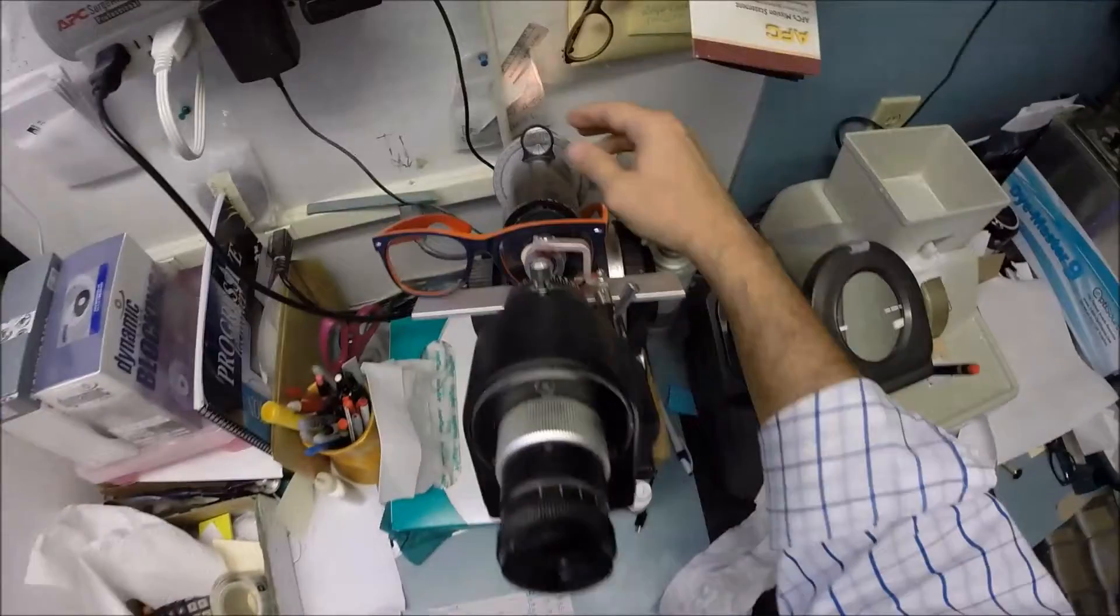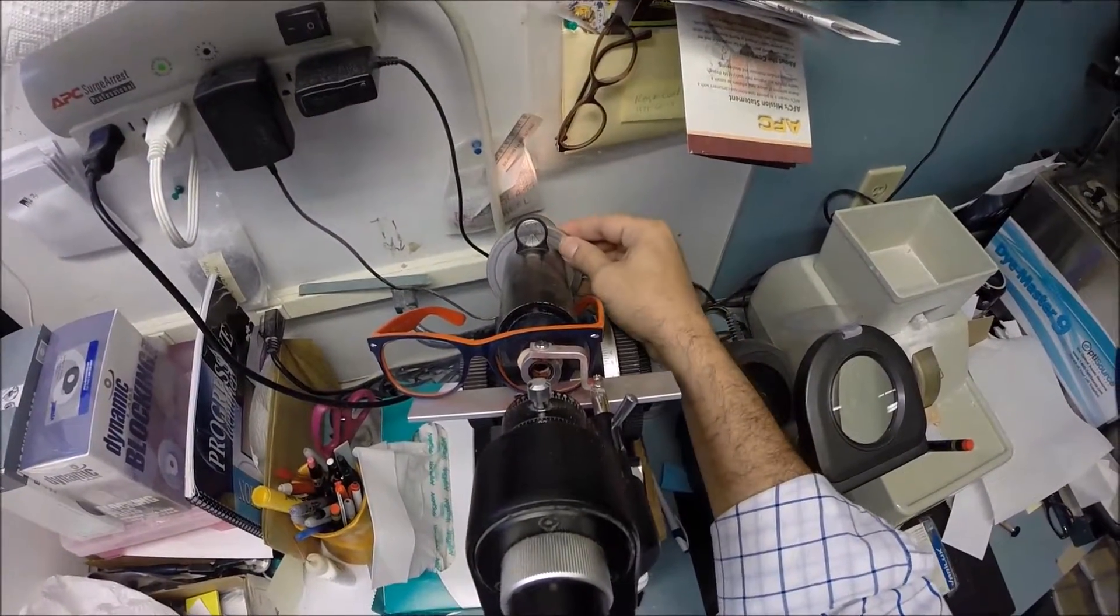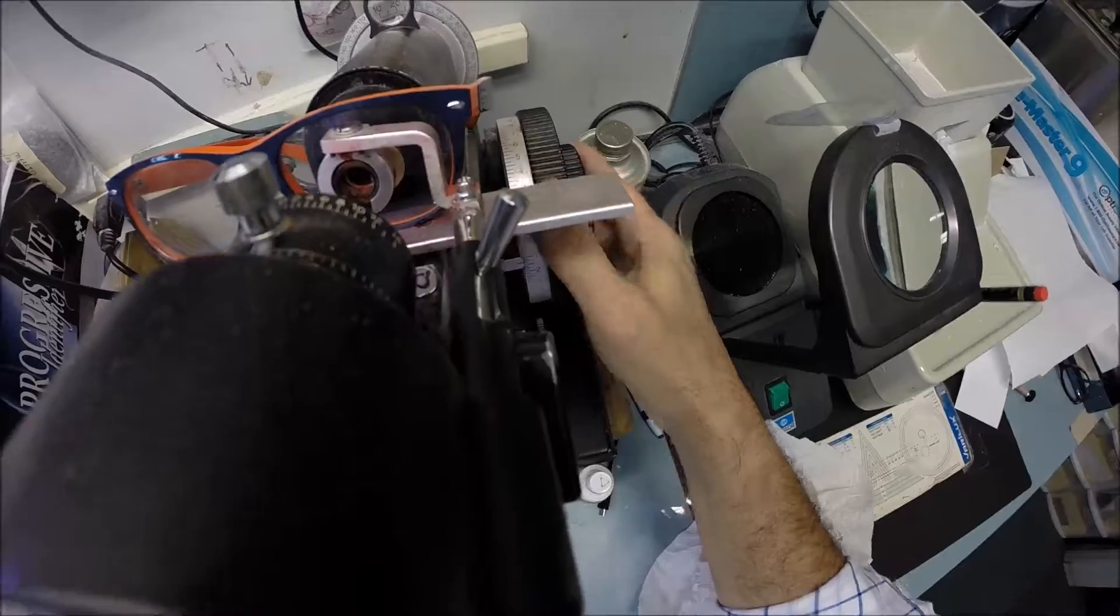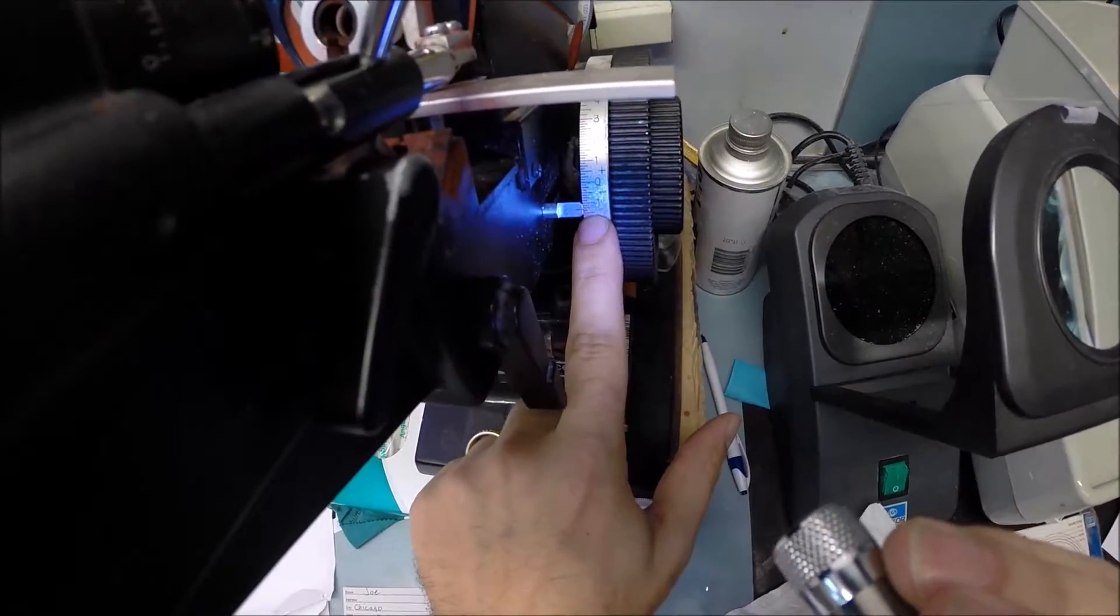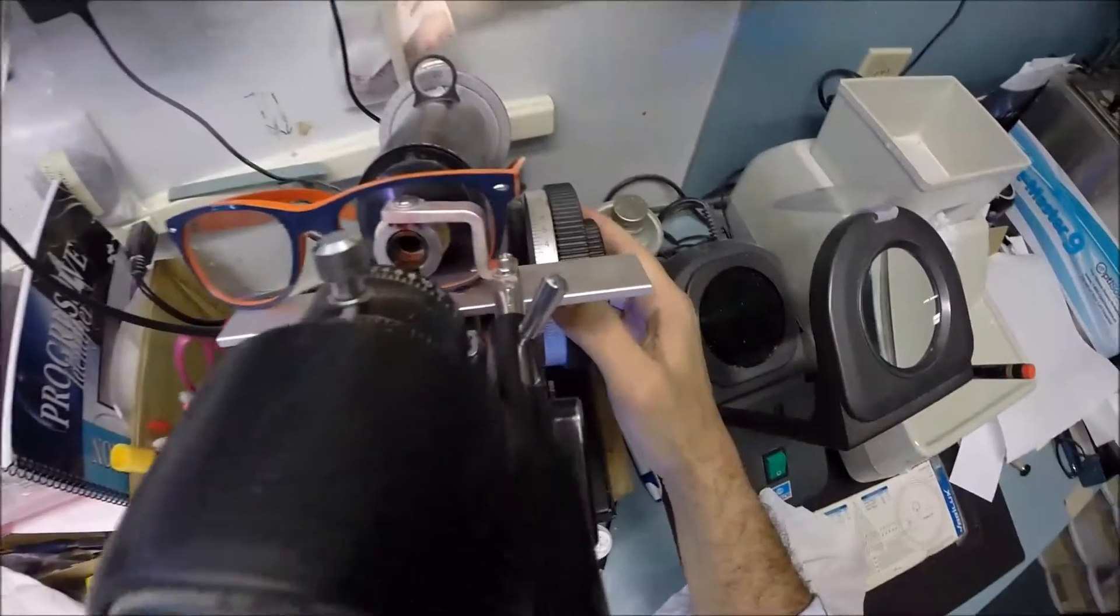I'm going to measure right where that red dot is, the optical center. That is your pupillary distance for your left eye. I'm going to spin the axis wheel back to 20 and measure.